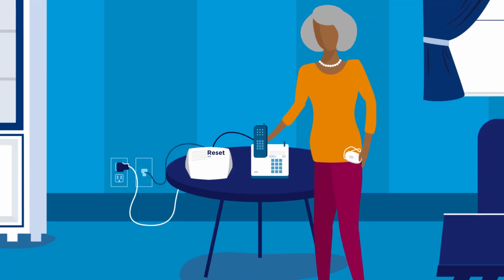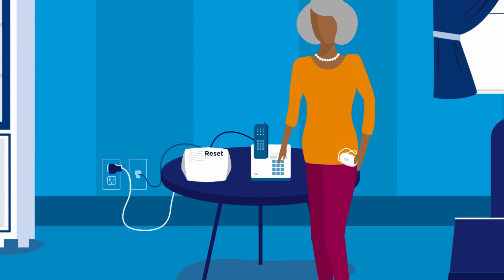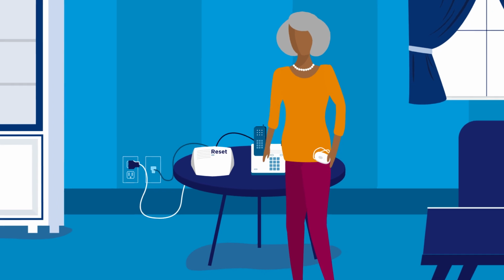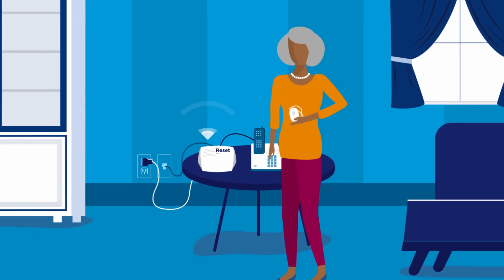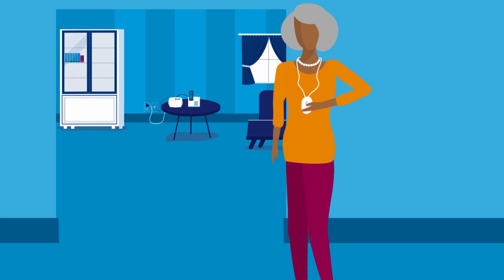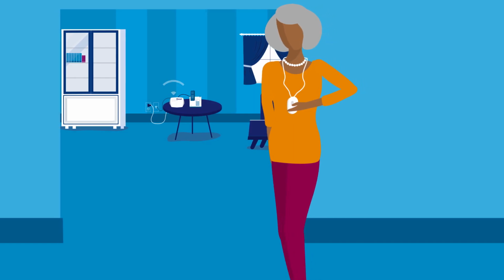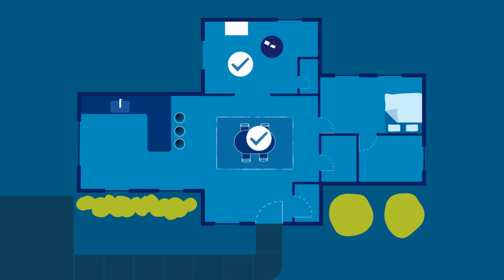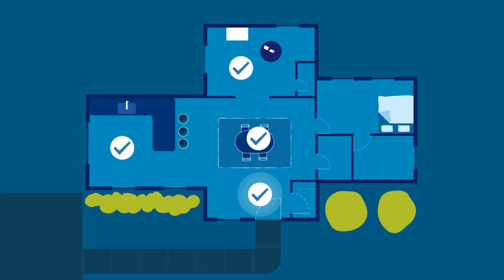Next, we'll test the range of your help button. Start by pressing and releasing the blinking reset bar on the home communicator. The home communicator will say, "Begin the range test." Put on your help button and press it in each room of your house. If the home communicator responds with a beep, it indicates that the help button is within range and will be able to send a help call if necessary.